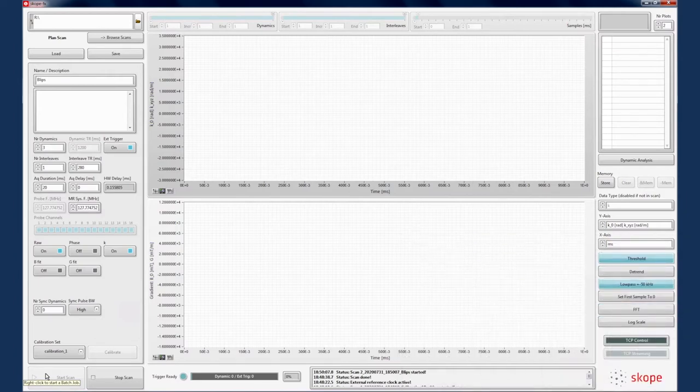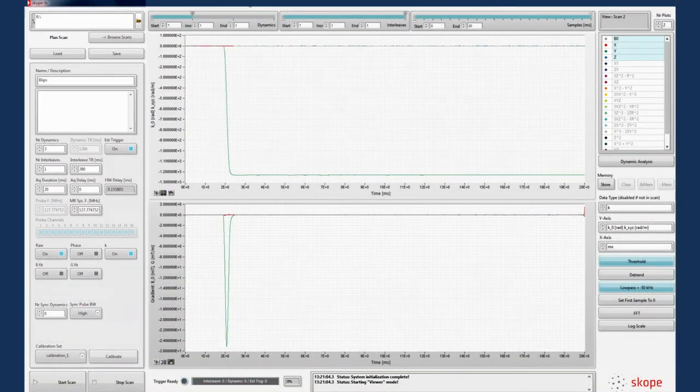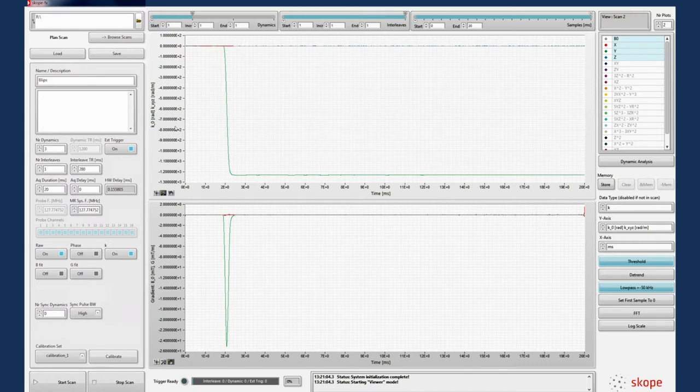As the triggers are played out, we can see the scope system acquiring data. Data is automatically processed on the acquisition system after the scan is completed. Here, we can now inspect the gradient and k-space waveforms on ScopeFX.